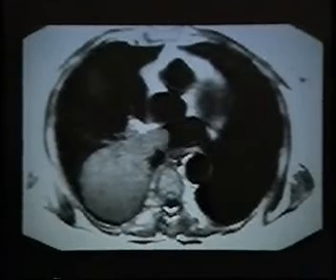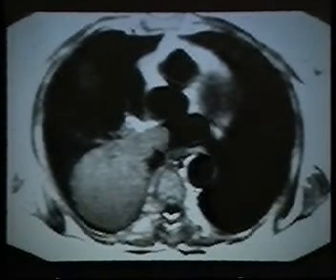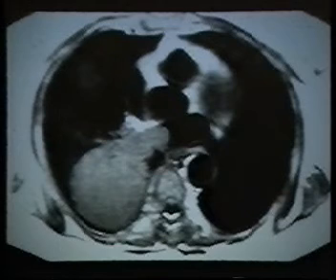The difference between these two studies is how much time and effort you want to spend in getting your study. All these studies are done with cardiac gating. When you do cardiac gating, you're looking for some high point of the EKG that you can trigger your machine from. And if you do not get a good differential, if the R wave and the T wave, which in this patient were very much similar, then the machine triggers off the R wave sometimes, off the T wave sometimes. You don't get gating, and you wind up with a conglomeration of shadows that are totally useless.